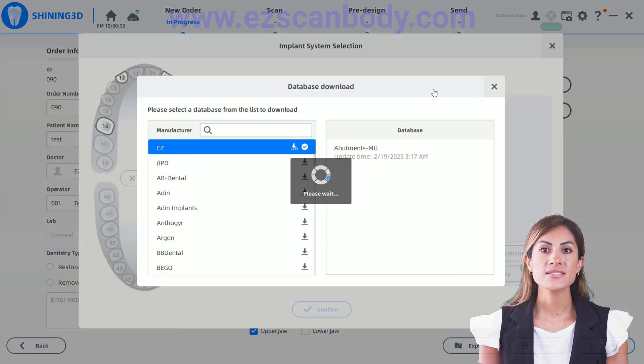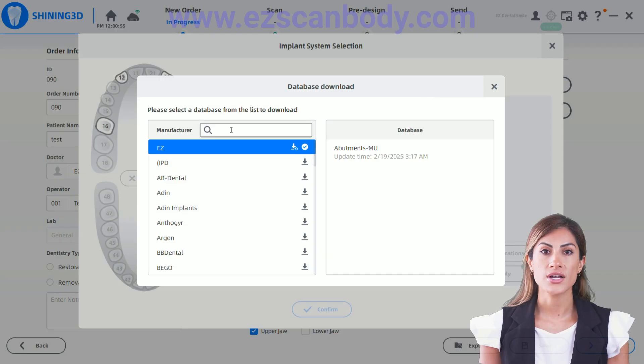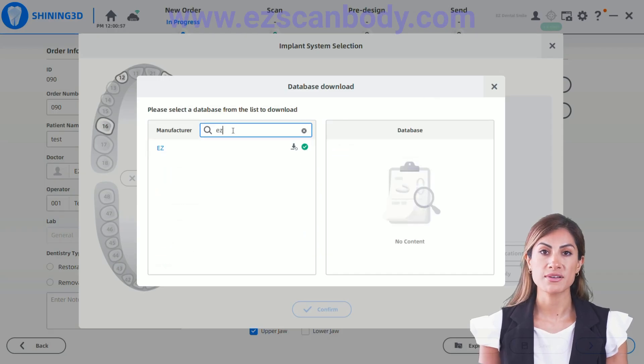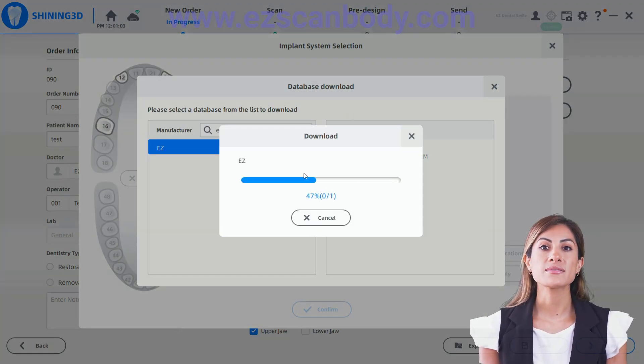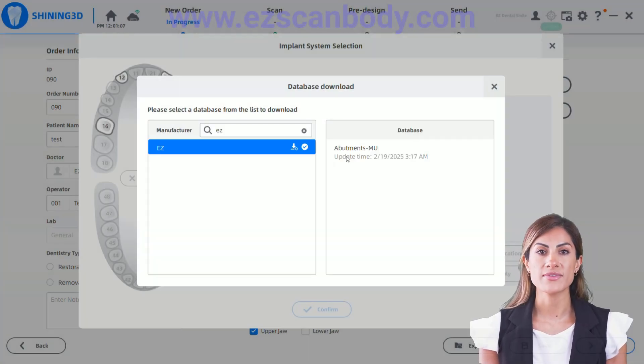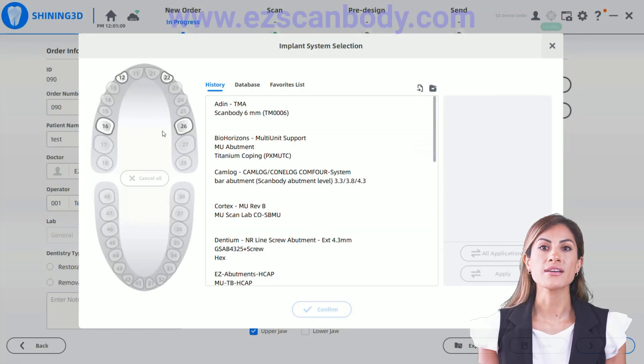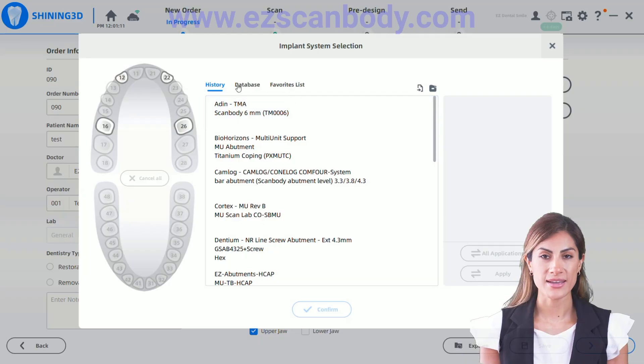In the Implant System selection, choose the system from the list. If it's not listed, download it from the database. If it's still unavailable, you can add it manually.